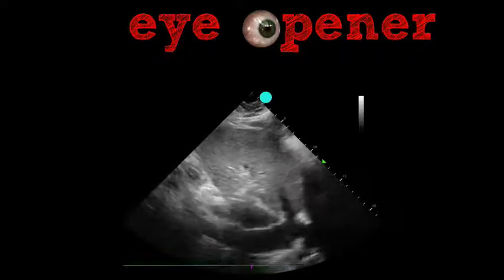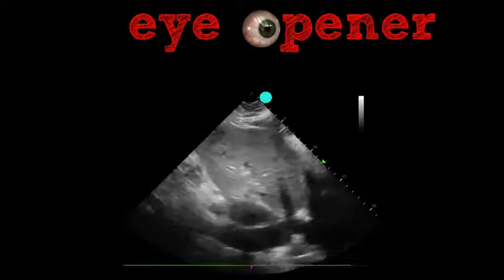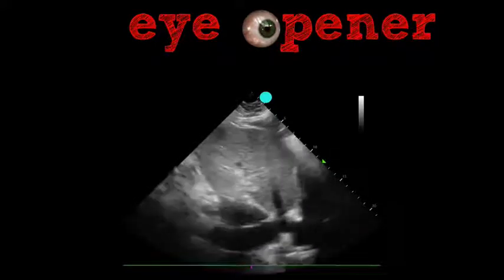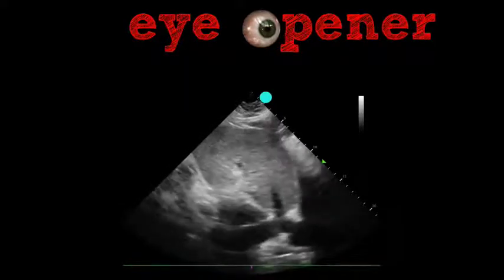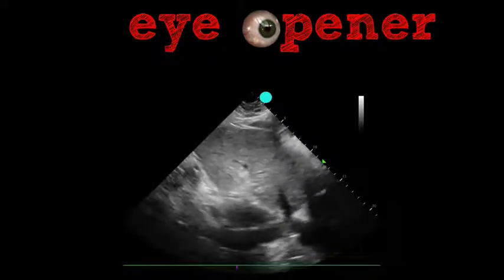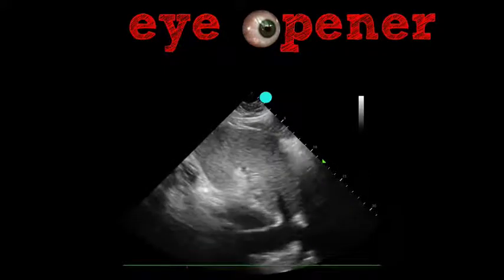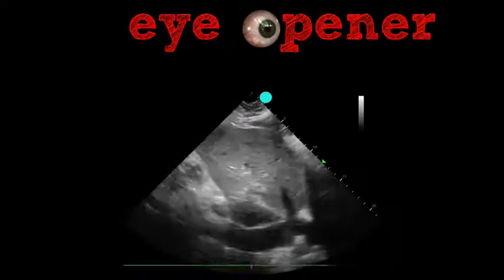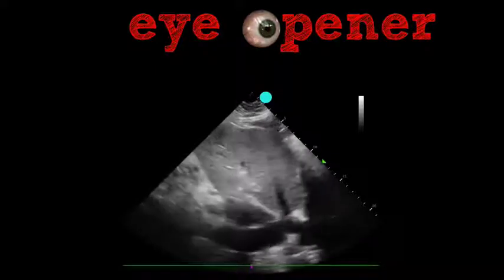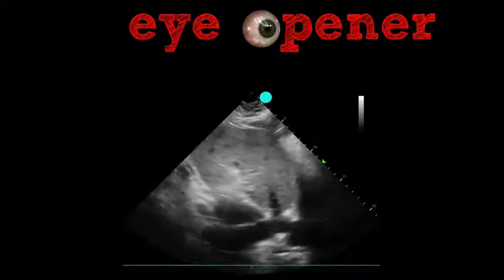And then we take a look at the IVC, and if we look for the collapsibility of the IVC to see whether it's greater or less than 50%, this appears to be a little less than 50% collapsibility with inspiratory effort. And the IVC appears dilated more than 2 centimeters, so we'd give that a high value of 15 millimeters of mercury estimated for the central venous pressure. So maybe just a mild pulmonary hypertension in this guy, but kind of barely making it there. Not exactly what we'd expect in somebody with a massive pulmonary embolism.